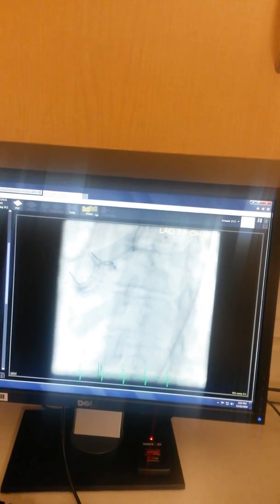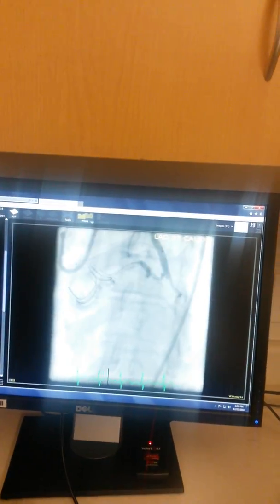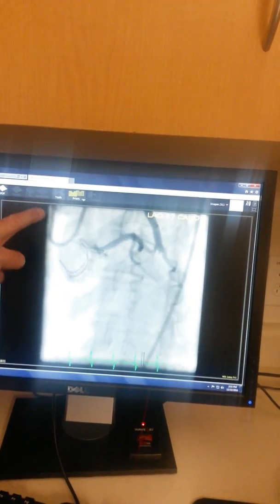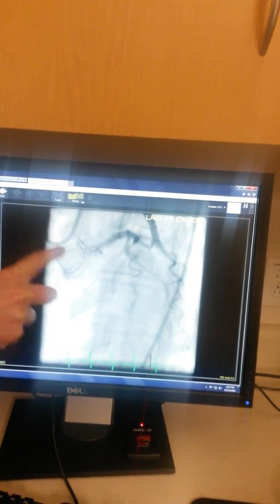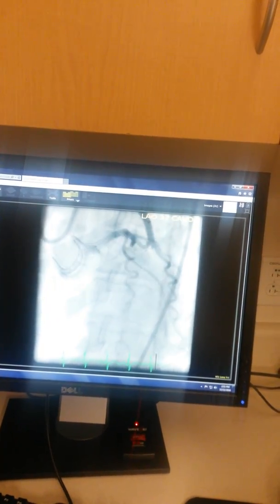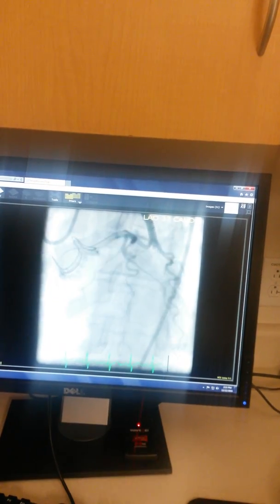What you'll see next is we needed to deal with this stuff up here. What I ended up doing was taking this catheter out and getting a second catheter to come in here gently. Now that the left main is open, it'll be easy for us to get a catheter in there. So you were able to go down by the valve with a catheter? Yep.